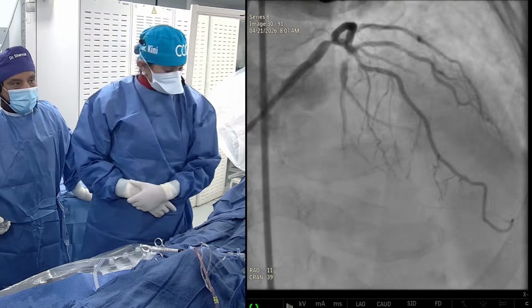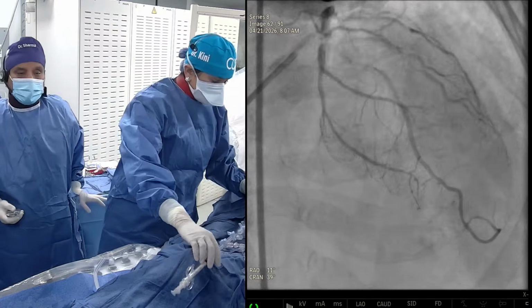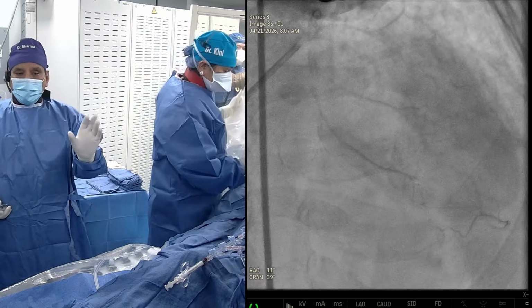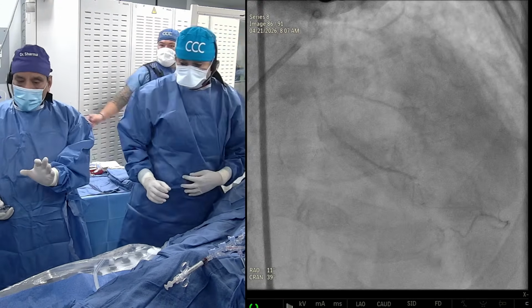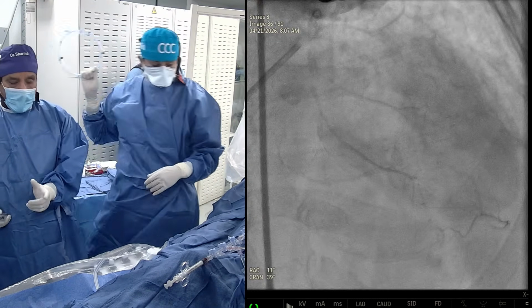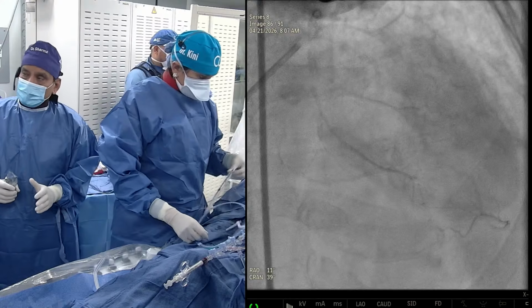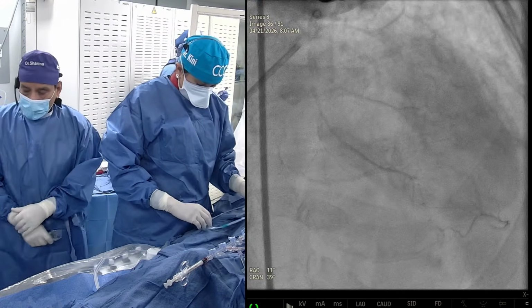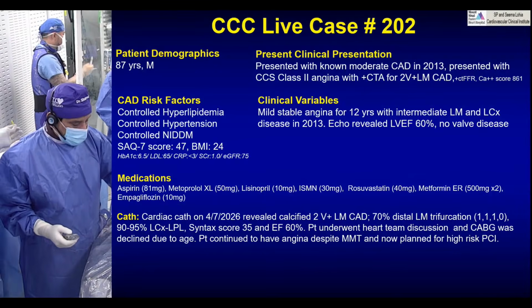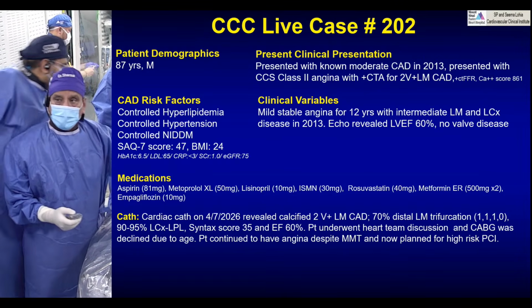And then the question comes back to the Impella issue. Although it could be an ideal case because of complex anatomy, the EF is normal, and knowing the recent data of the BCIS-3, which we are going to share, we are a little more selective, because these things then come under a high level of scrutiny, and we want to use it appropriately. But yes, if we start having any trouble, we'll put it in right away.